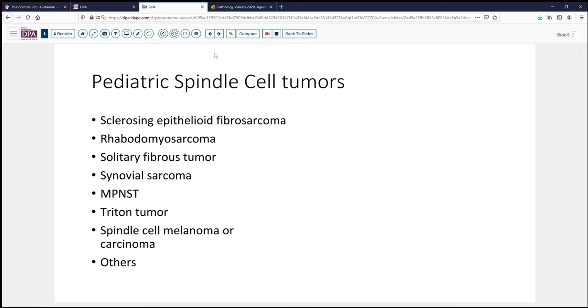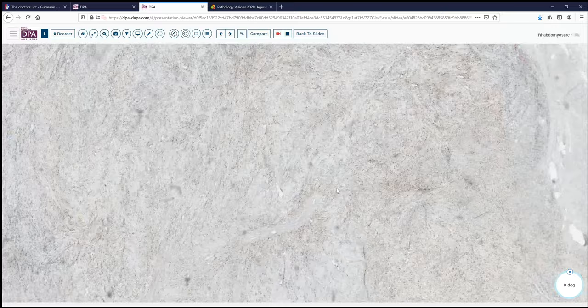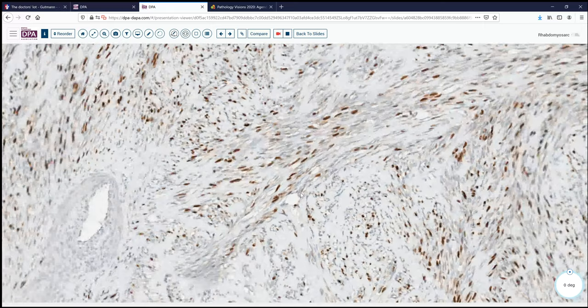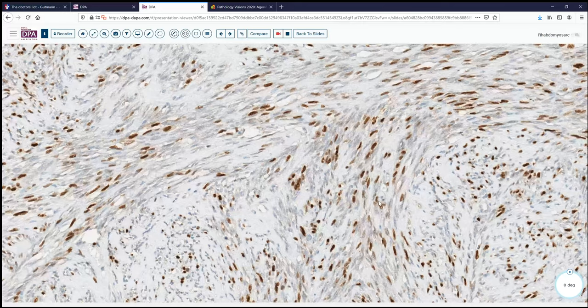With this in mind, a number of further studies were done, including cytogenetic studies as well as immunohistochemistry. One of the immunohistochemical stains shows a nuclear stain lighting up most all of these spindle cells with positive nuclear staining. This is a stain for MyoD1, indicating myogenic differentiation in this tumor, which moves us fairly quickly into the rhabdomyosarcoma realm.